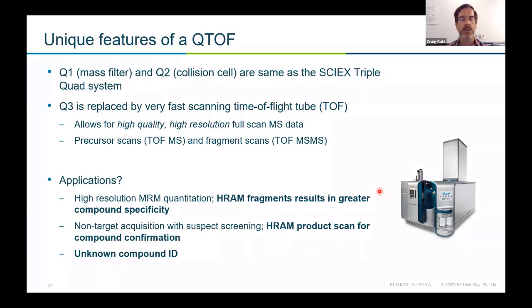And so for us doing that kind of work, what I'll be talking about is using this non-target acquisition for suspect screening and using the fragmentation pattern to really confirm what we're seeing, as well as doing some unknown ID.